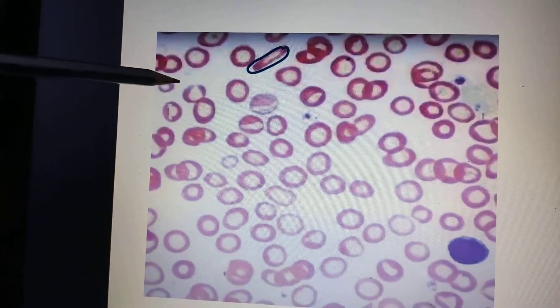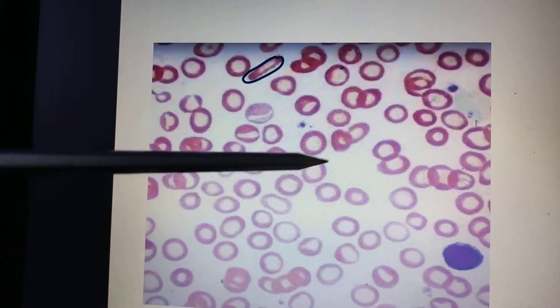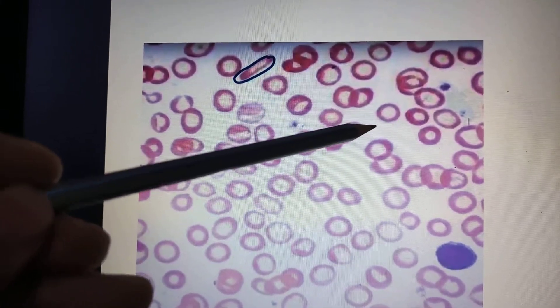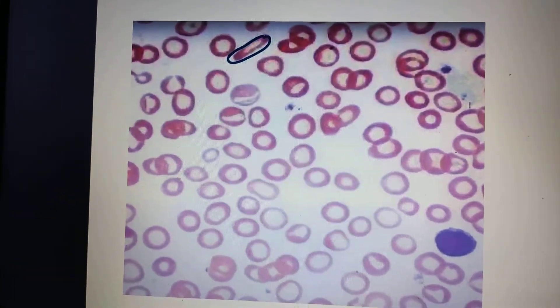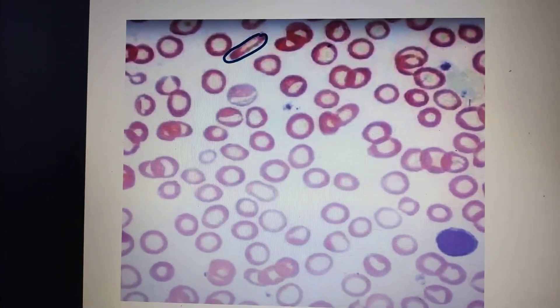Along with this, you can see the size of the RBCs is not uniform. Look at this size, then this one, then this one — they are mixed: some are smaller, some are bigger. This variation in size is another key feature.